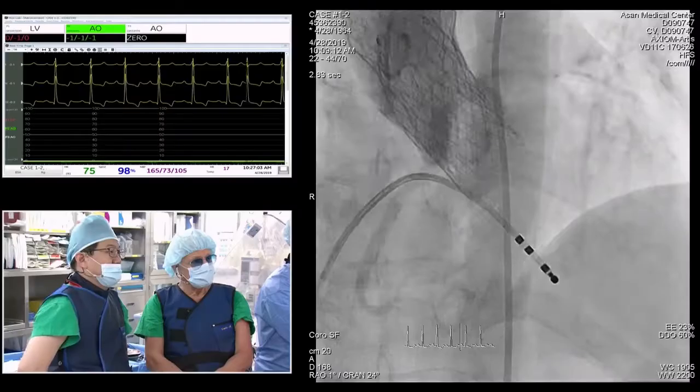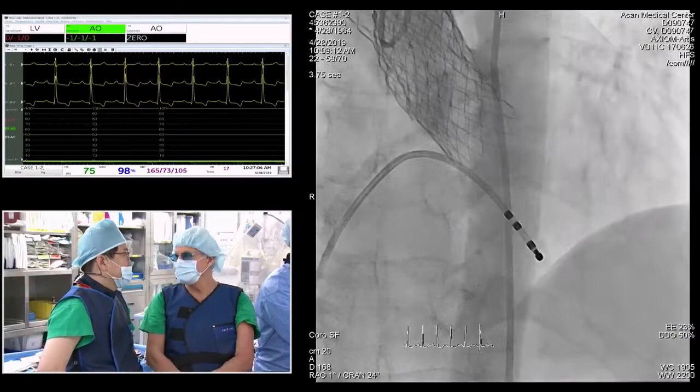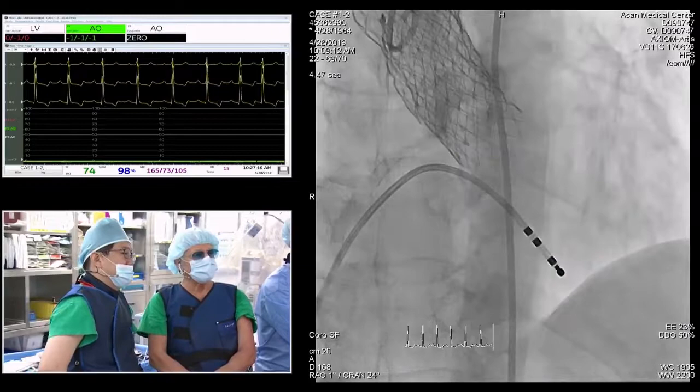So Eberhard, right now the EKG looks good. How long will you keep the pacer in? How long will you observe the patient? Just 1 day enough? Okay, 24 hours. Yes. The EKG didn't change. There was no block. There was no delay.